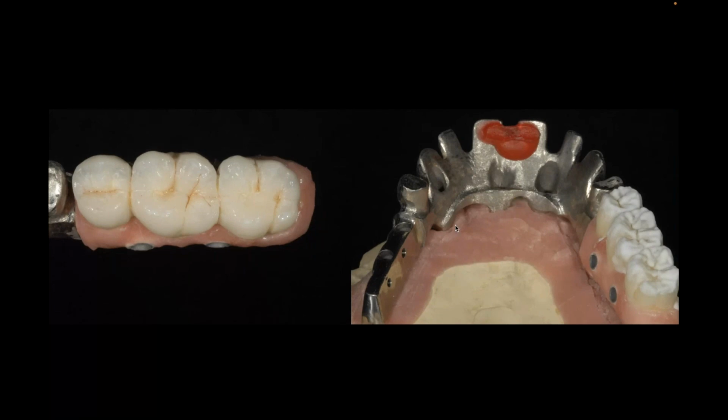I know that's a term we use a lot in denture, but to me, denture and crown and bridge are almost the same thing today. I think we define them too much and act like one's so much different than the other. No, I want bilaterally balanced occlusions. I want equal simultaneous contact.